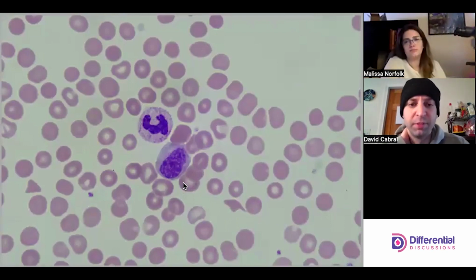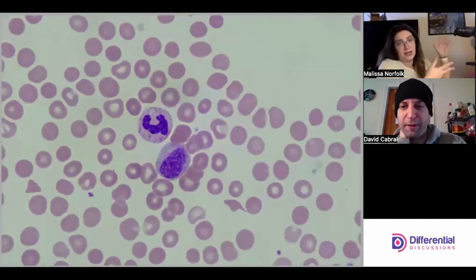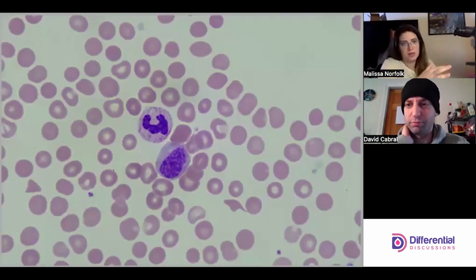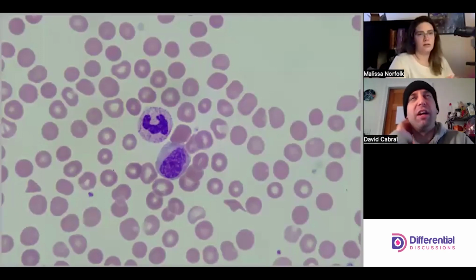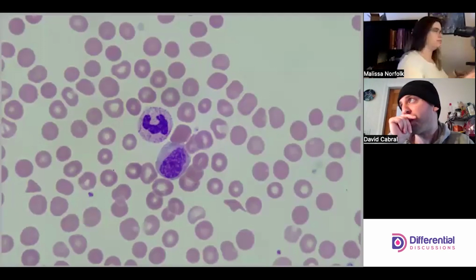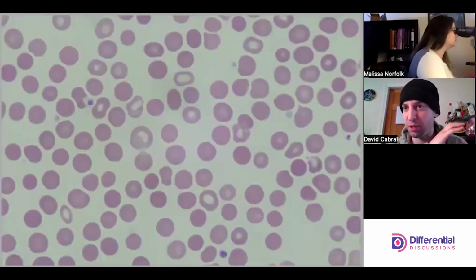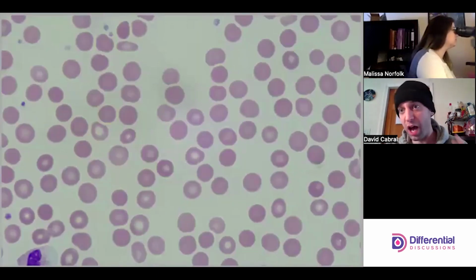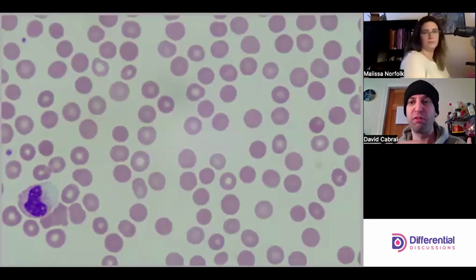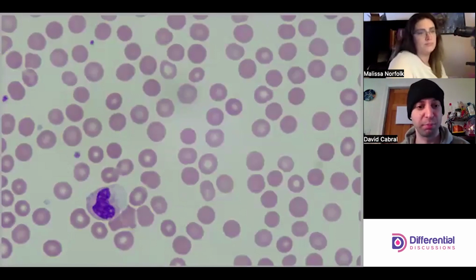This neutrophil has a little bit of toxic granulation. It's not as toxically granulated as the last one we saw, but it does have some toxic granules. On the red cell populations, if a person naturally has a microcytic population of cells for whatever reason and is then transfused with a lot of normal red cells, the histogram of your red cells will have two distinct peaks.